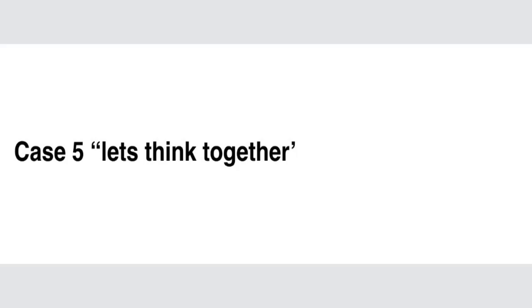I have one question here. Why cut the palate off? Well, some patients don't like the palate because of its thickness. They would like to take the palate off. So I don't cut it, but I have some patients who have asked me to cut the palate because they would feel much more comfortable. This is one of the questions that came up. I will try to answer more questions as I go with the presentation.